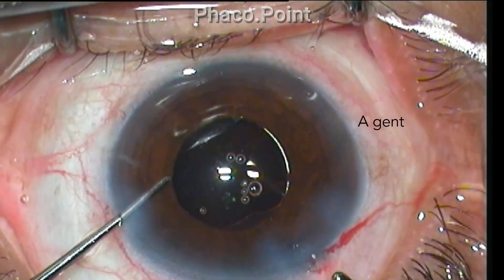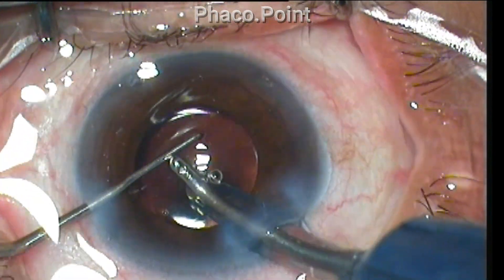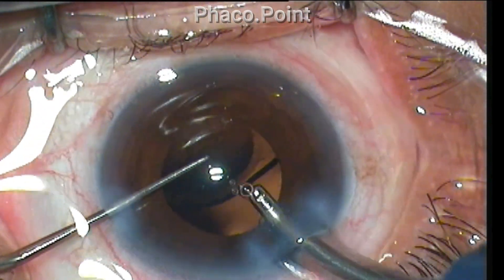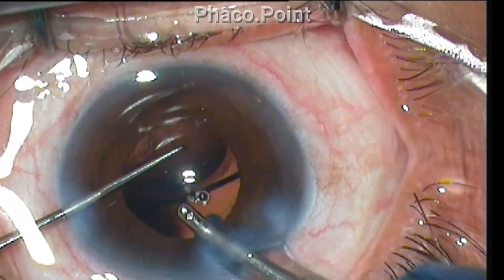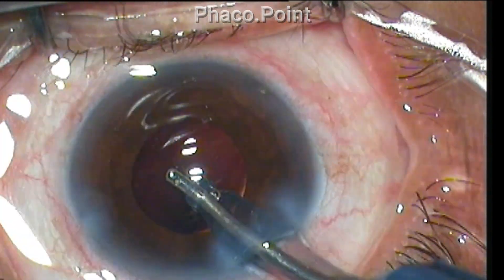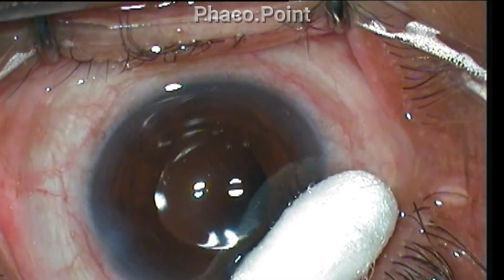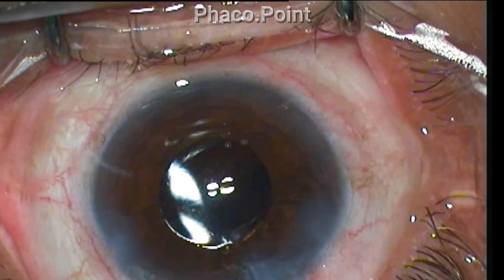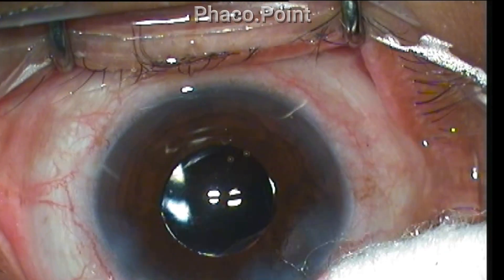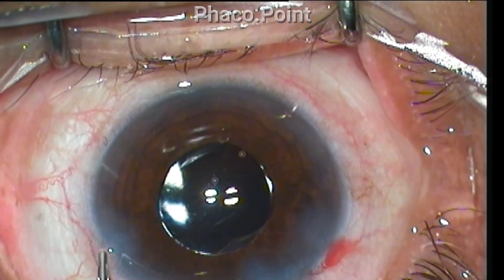Finally, a gentle Sheets-Yadava visco wash is done at the end of the procedure. Remember to enter with the coaxial I/A probe at low bottle height, then increase to your preset level of 90–100 centimeters once inside. Ensure adequate watertightness of the clear corneal incision and side port incisions before closing, because this patient will not have a protective patch when walking out of the hospital. End the case with intracameral moxifloxacin.